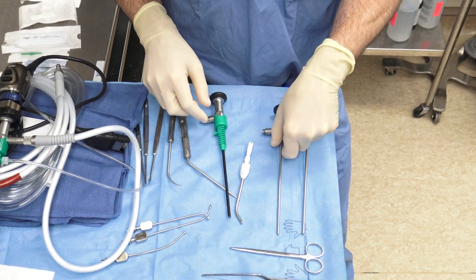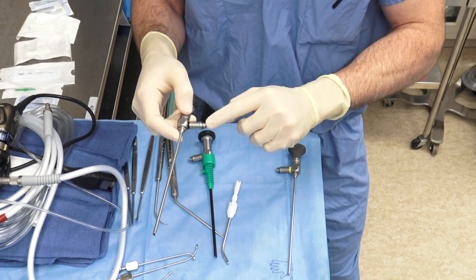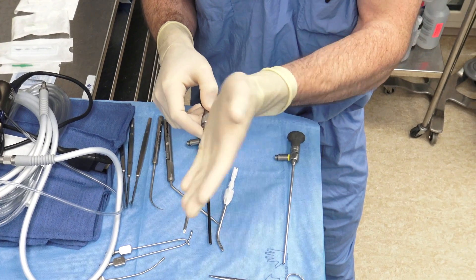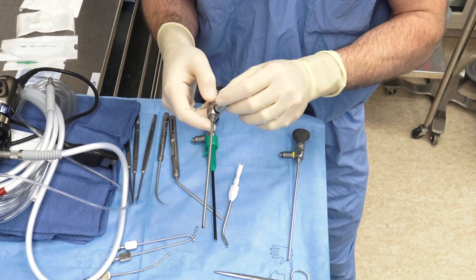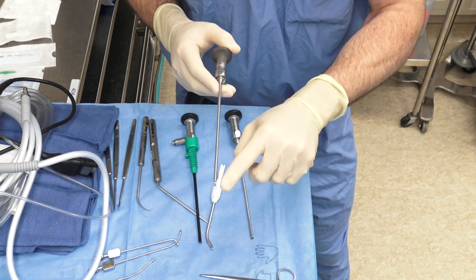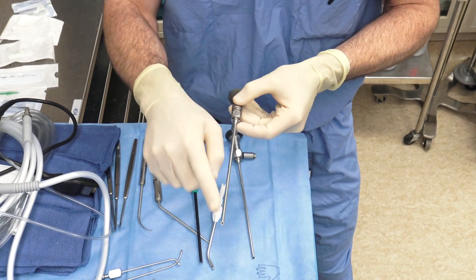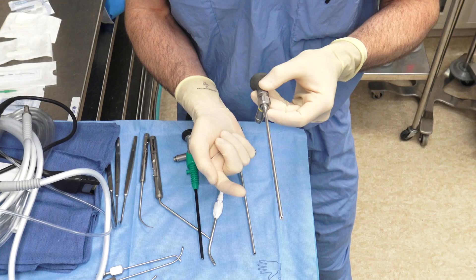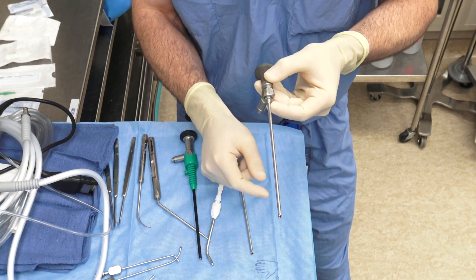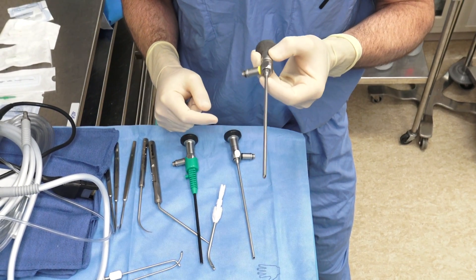The next one is the 45-degree scope — a slightly different setup. The light post comes out from the side, and this is now looking up, at 90 degrees from the angle of the camera to the light post. Lastly is the 70-degree scope — quite an angled scope. In this operating room we do not have a reverse post for the 70s, so it's looking up but the post comes out below. That makes it difficult to pass instruments through while looking up. We fairly rarely use a 70-degree scope.